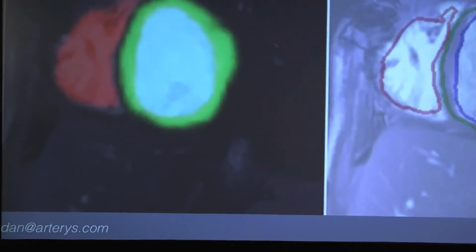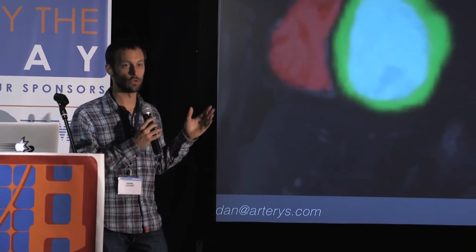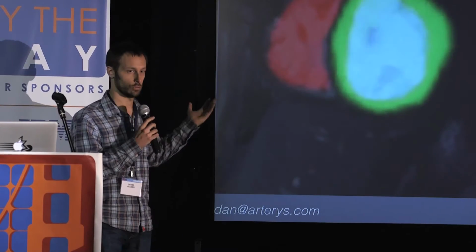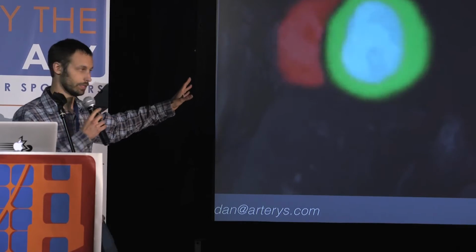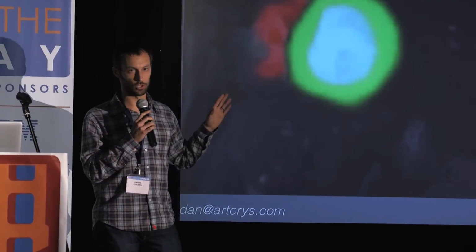And the first thing that's going to strike you is the red contour, which is the right ventricle, is very poor. If we think the goal of this whole procedure is to deploy the results of this model in our app where a radiologist will click a button and these contours will be created automatically, you can see the right ventricle in this case is not deployable. This would not be usable in a production app.